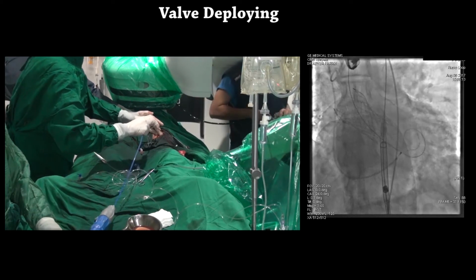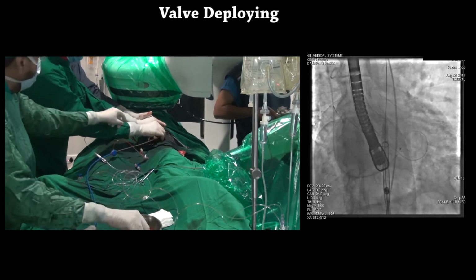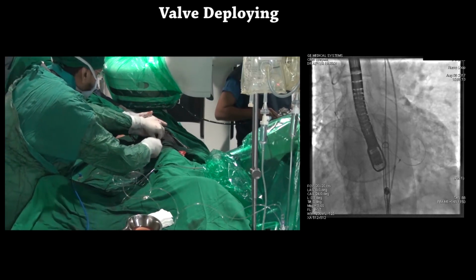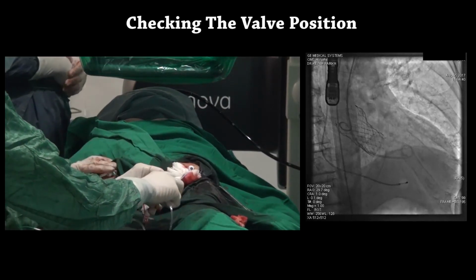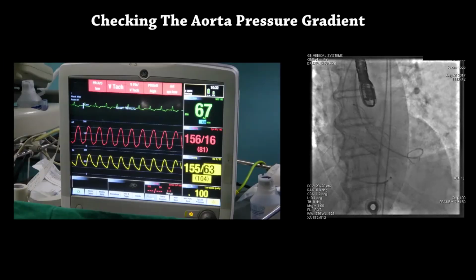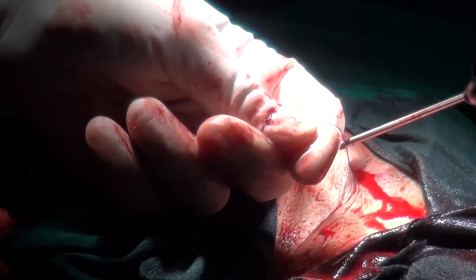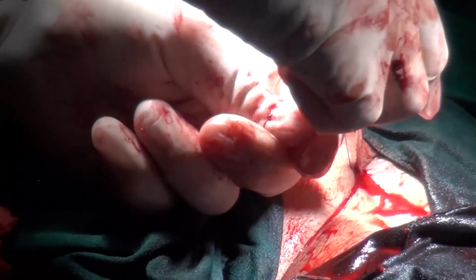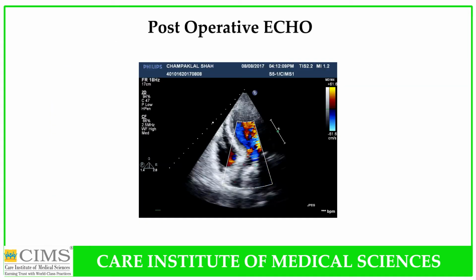TEE was also used for the positioning. Once the delivery system was removed, proper measurements were done across the aortic valve, showing total resolution of the gradient. An extra ProGlide was introduced, and finally the groin was closed with the ProGlide system. So you can see in a patient with tortuous aorta and 66-degree aortic root angle, the procedure was done very smoothly.